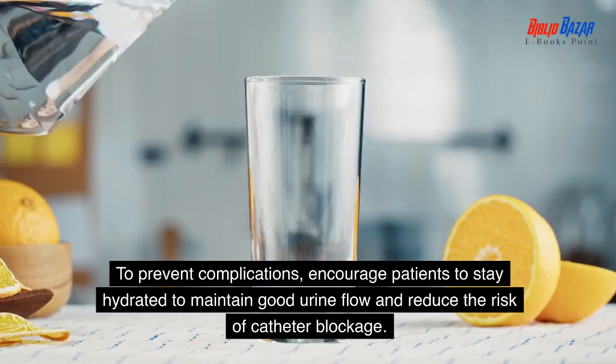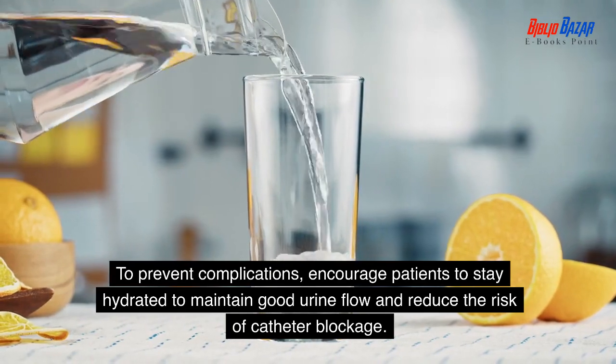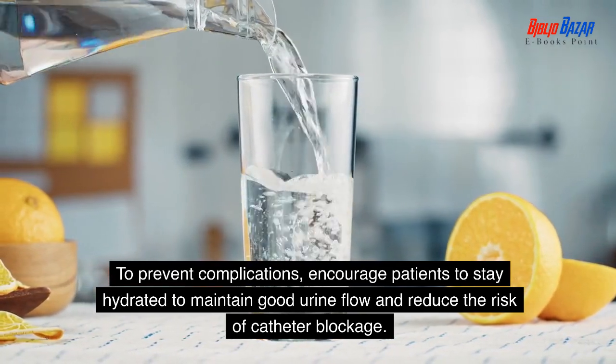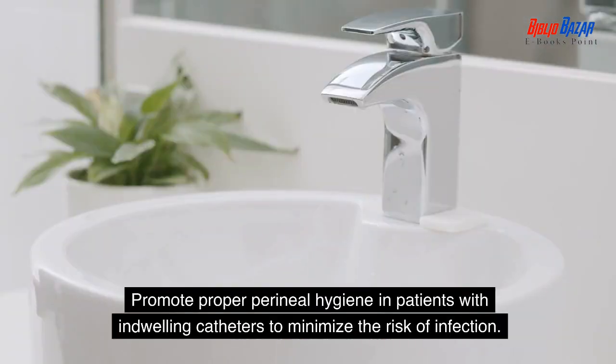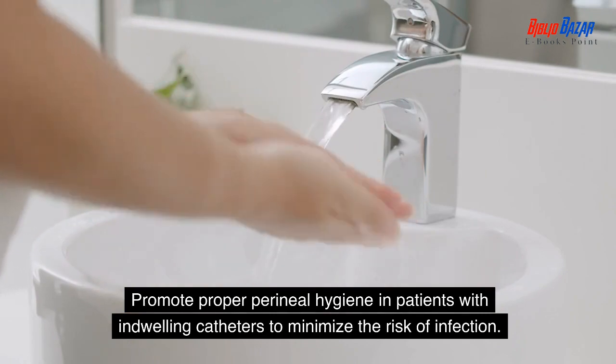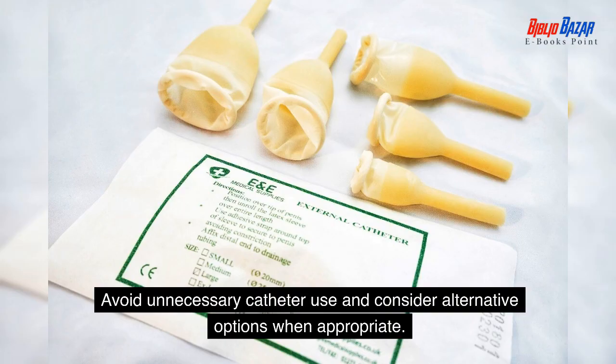To prevent complications, encourage patients to stay hydrated to maintain good urine flow and reduce the risk of catheter blockage. Promote proper perineal hygiene in patients with indwelling catheters to minimize the risk of infection. Avoid unnecessary catheter use and consider alternative options when appropriate.